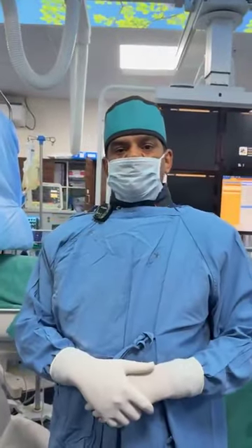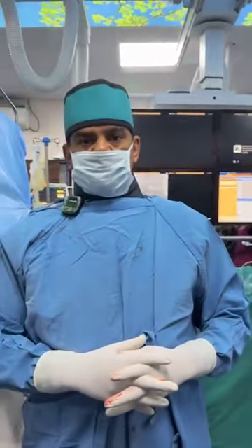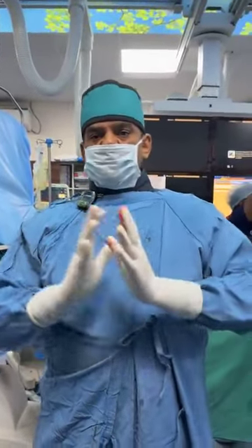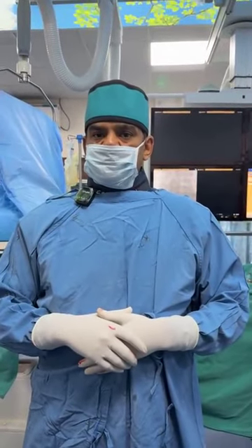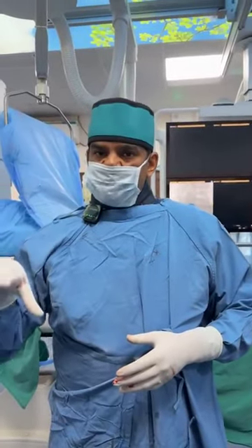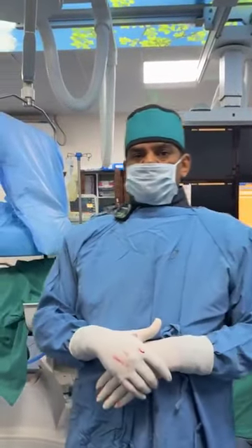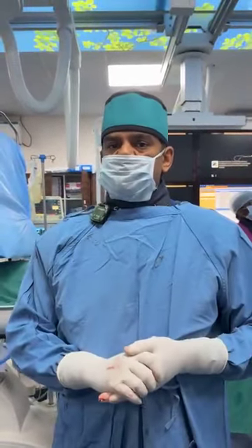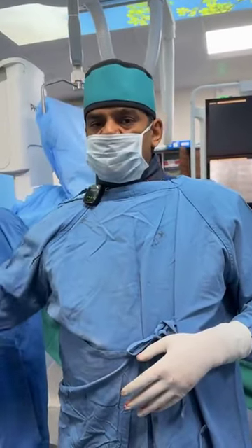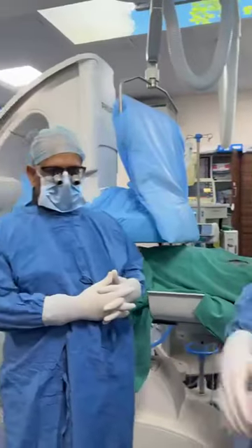As I told, we have been doing this complex hybrid procedure. What is a hybrid procedure basically? A hybrid procedure has a part 1 and a part 2. Part 1 is a surgical procedure and part 2 is an endovascular procedure. We have been working together for more than 10 years, Padhi Bhai and me, and we have our operating areas on the same floor, very close to each other. So we plan the case in such a way that we just follow through. The surgical procedure is done first, the patient moves into the cath lab immediately and we finish the procedure. There is no time lag.